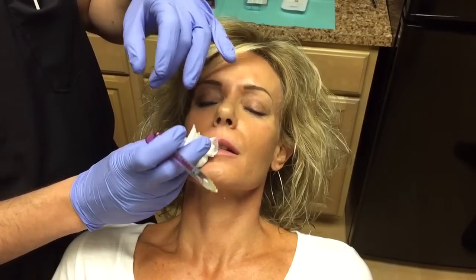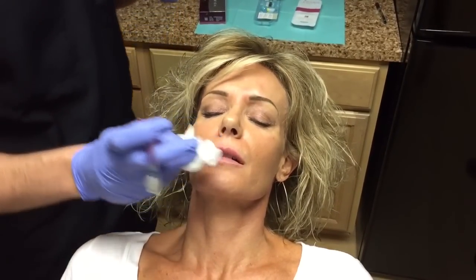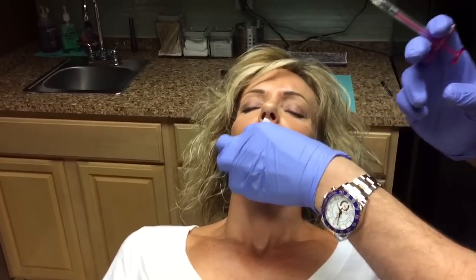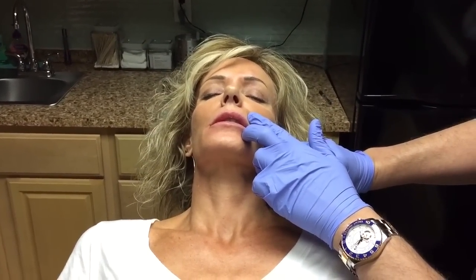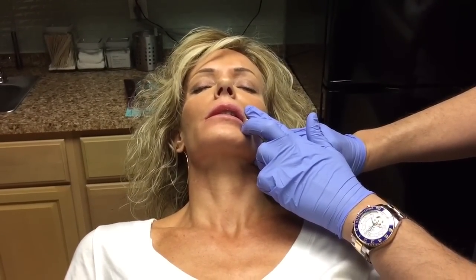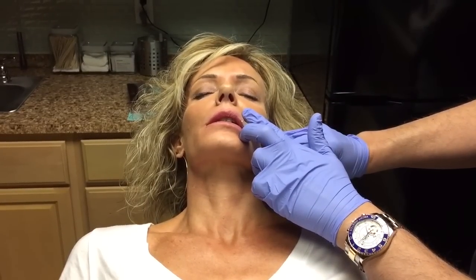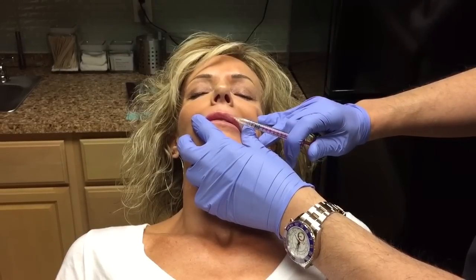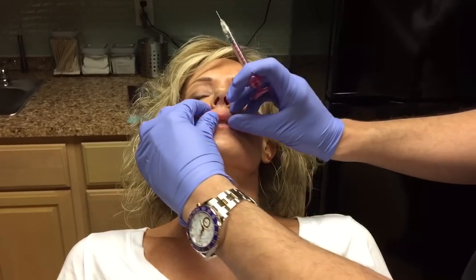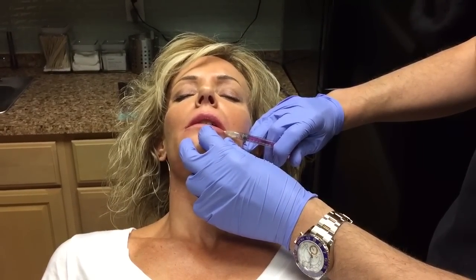So what this does, it introduces the lidocaine into the lip, so the lip starts numbing further. I spread a little thin layer on both sides, then I go back and add more to it because the lips get more and more numb, more and more comfortable. Just a little like that, perfect. There's usually some big blood vessels right at the corner. You want to stay more superficial. In some patients, those blood vessels can be tortuous, kind of like a pretzel almost. And you may end up hitting both ends of it or several ends of it, and then you get this big hematoma on the lips. It's a very smooth product. When you put it in, it's almost impossible to get lumps if you're careful with the technique.